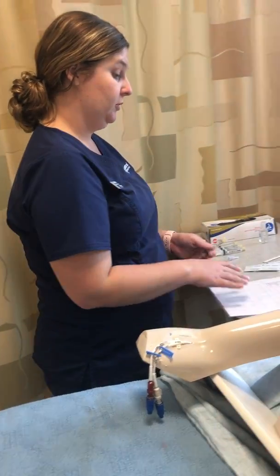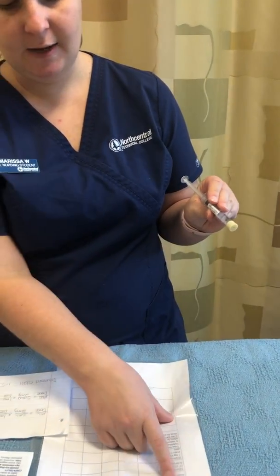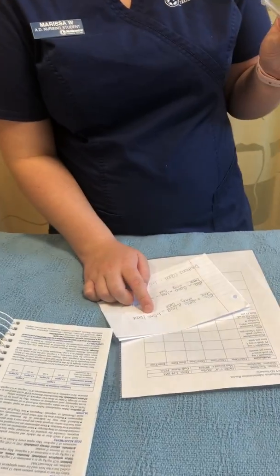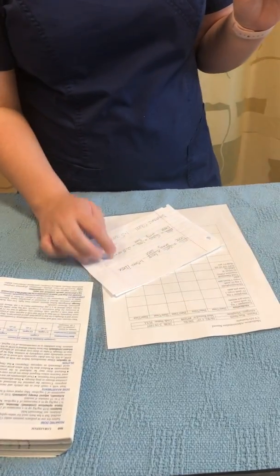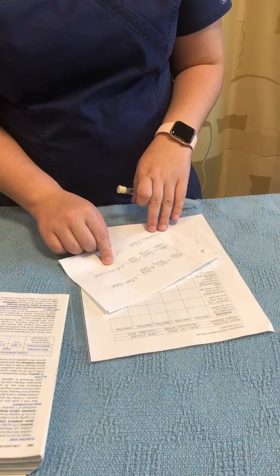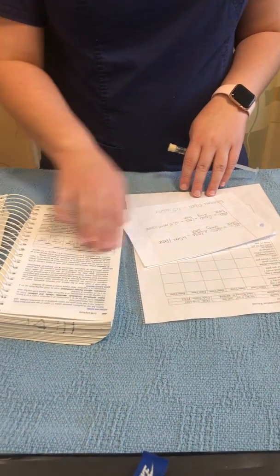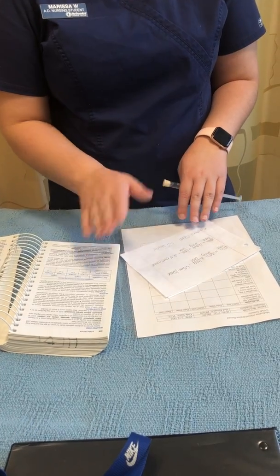Well, actually, before I do dose accurate, I have to do my math. Looking at my math, this is 2 milligrams in 3 mLs, and I need to give 1 milligram. So doing my math, I figured out that I have to give 1.5 milliliters for my dose. And then I also figured out how long I'm supposed to give this medication over. Per this book that I looked it up in, 2 milligrams is supposed to be given over 1 to 5 minutes.